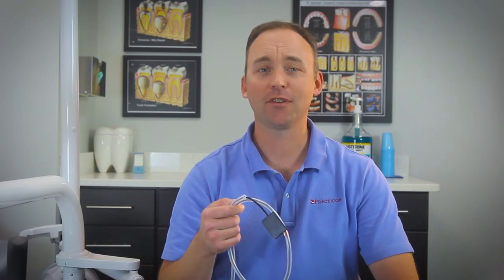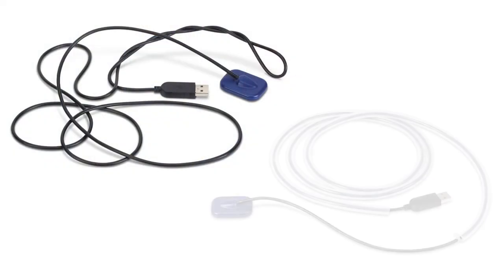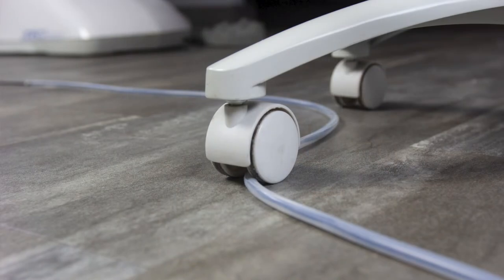Hi, David from Practicon here to tell you about WireGuard, the simple solution that turns your delicate sensor cables from this into this. Invented and proven in a busy practice, WireGuard extends the life of sensitive digital radiography sensors by protecting their cables from damage.